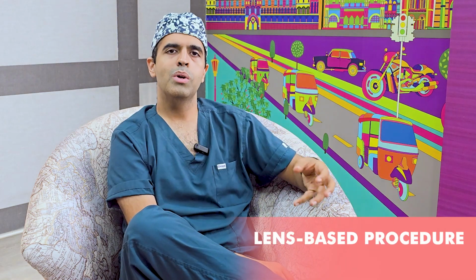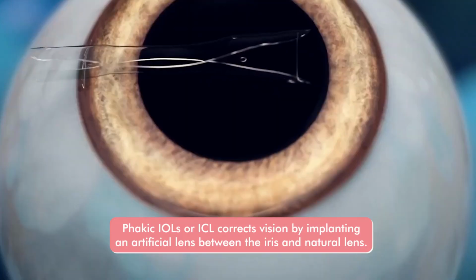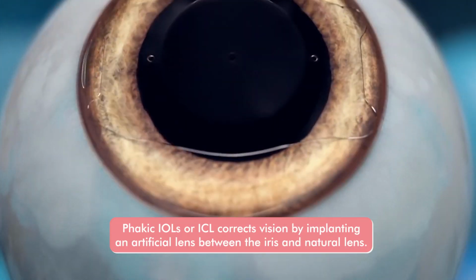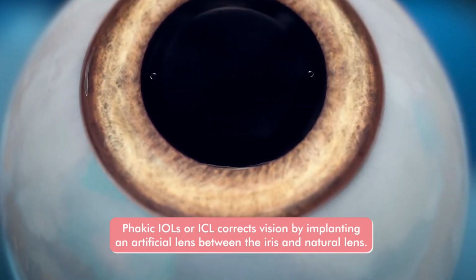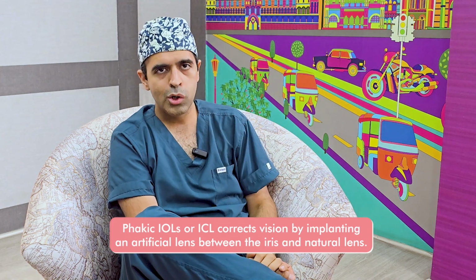But for patients who have powers more than 8, we go on to lens-based procedures, known as a Phakic IOL or an ICL, wherein a lens can be placed inside the eye and that treats your power. The ICL takes care of your power up to 22.